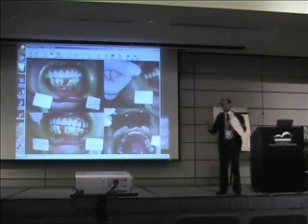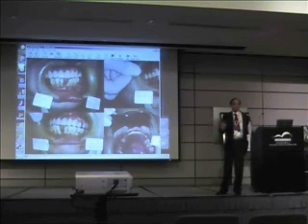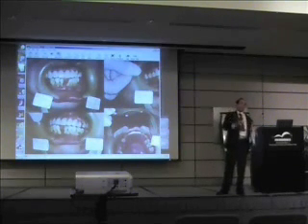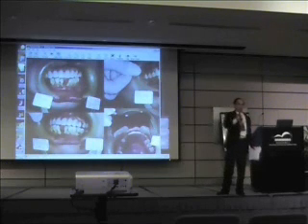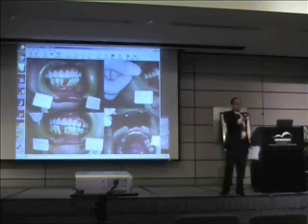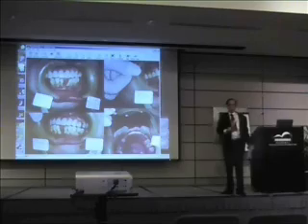So you can have patients where you suspect your implant bone is too soft, use soft liner. Even cases where you think you want a healing period to take place, use soft liner underneath. You can buy it, it's Secure, isn't it? Secure soft liner, and I think TWL, you all got it. Either Secure soft liner or the hard type. The soft liner is useful, very useful.